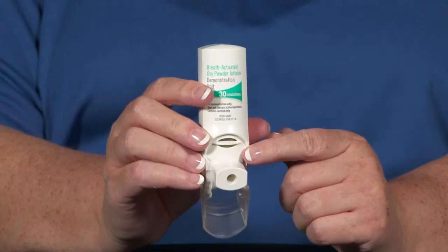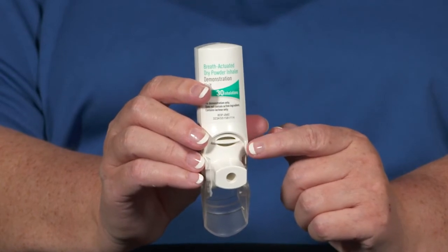After you've blown all the air out of your lungs, keep your head up, put the Respiclick in your mouth, close your lips around it like you would a straw. Don't cover up these holes with your lips or fingers. Now take a fast, deep breath in through your mouth until you can't breathe in anymore like this.